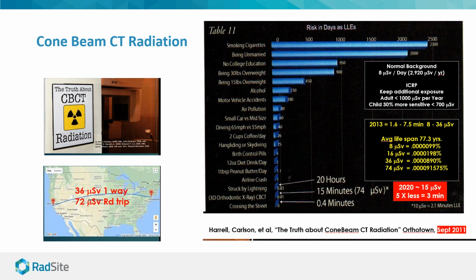Yeah, absolutely. Thanks. One thing that always comes up about ConeBeam, in orthodontics and many others, is the radiation dose. And this was an article that I helped write with Dr. Sean Carlson and others about the truth about ConeBeam CT radiation back in 2011. Now, this was based on older, not the low dose and ultra low dose technology.